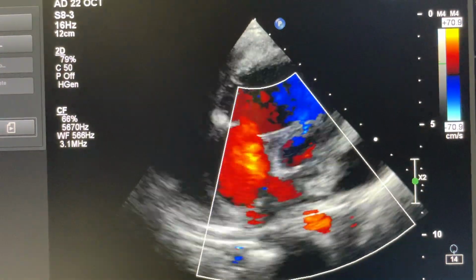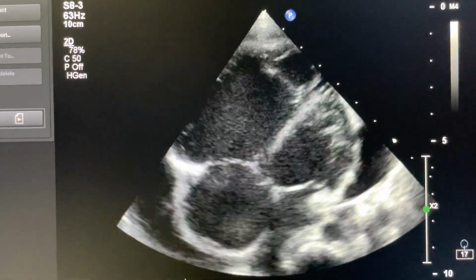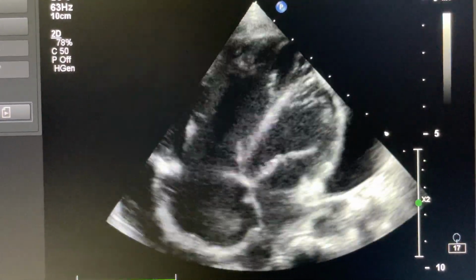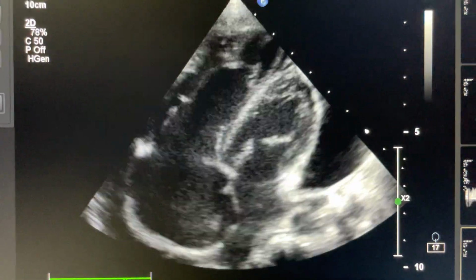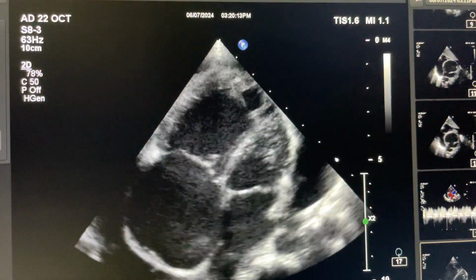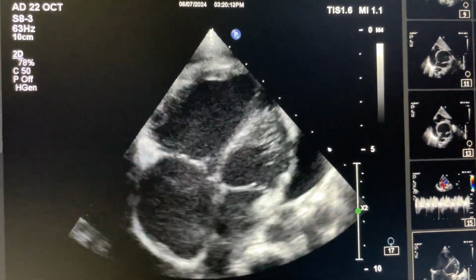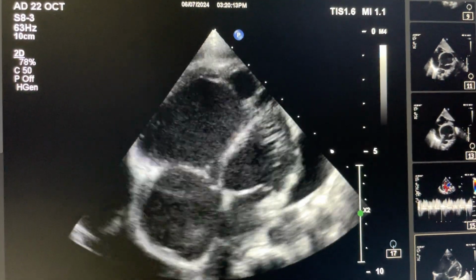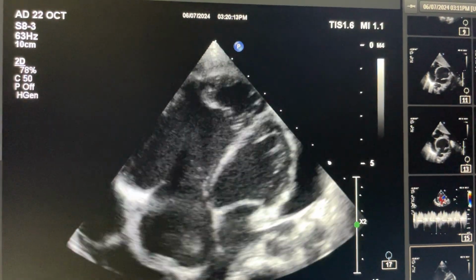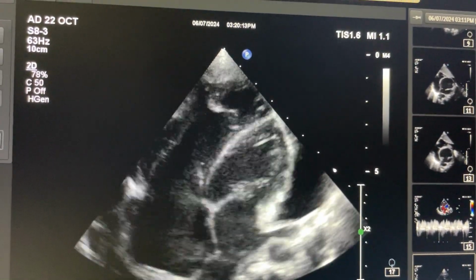In the four chamber view, you can clearly see no right atrium and right ventricle collapse in this case, indicating absence of tamponade. One important thing is that when there is ASD, right atrium and right ventricle are already volume overloaded, so tamponade will appear late in this case. Even if clinically there are tamponade-like findings, echocardiography may not show them because of the volume or pressure overload.